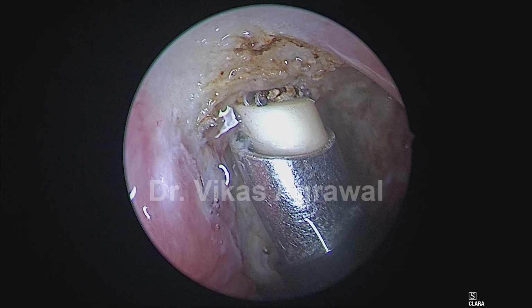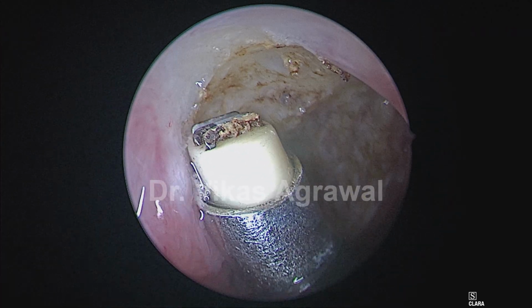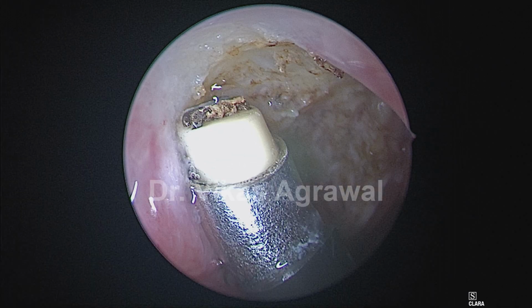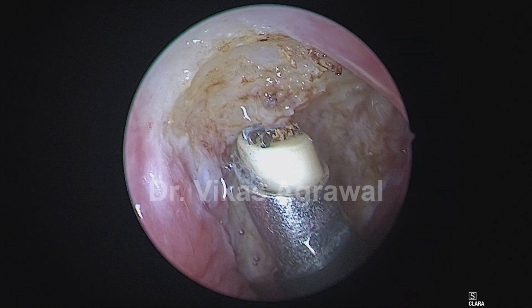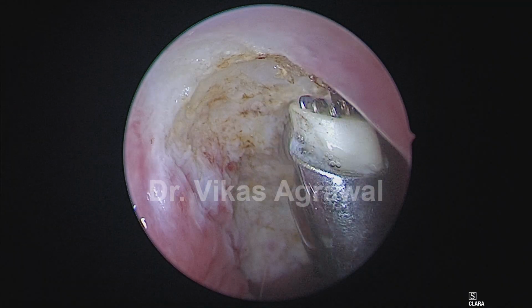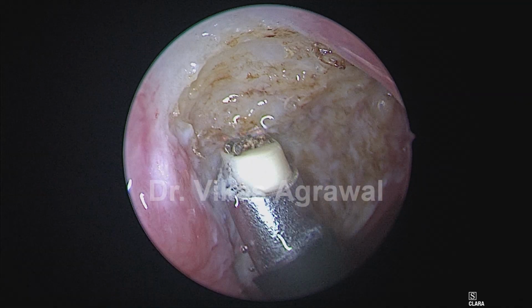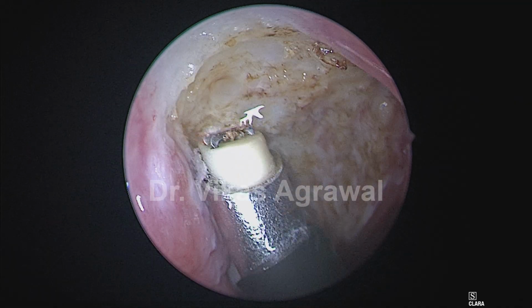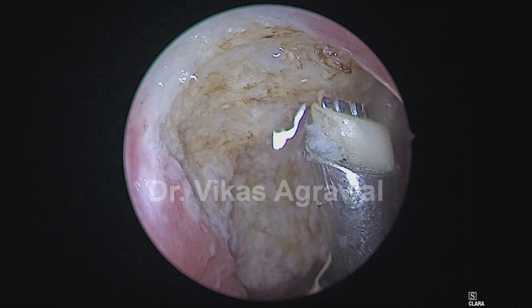Now you see, layer by layer, I have removed. Can you see the periosteum now very clearly? That's the final thing. Don't open up this periosteum. But I am removing all the lymphoid tissues layer by layer completely. That's the superior boundary. Now I am following this superior boundary posteriorly.